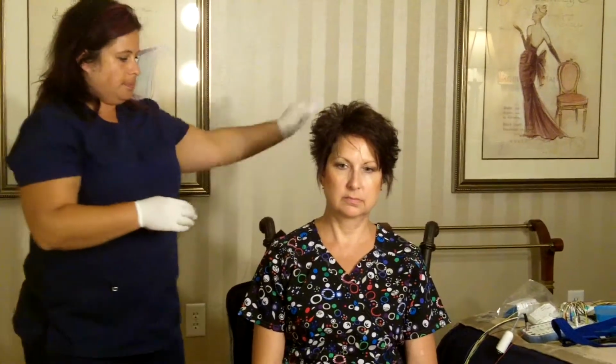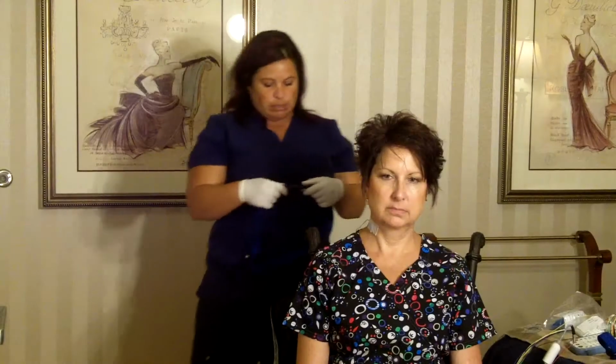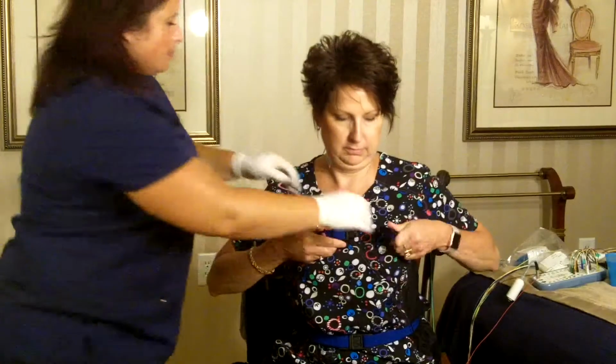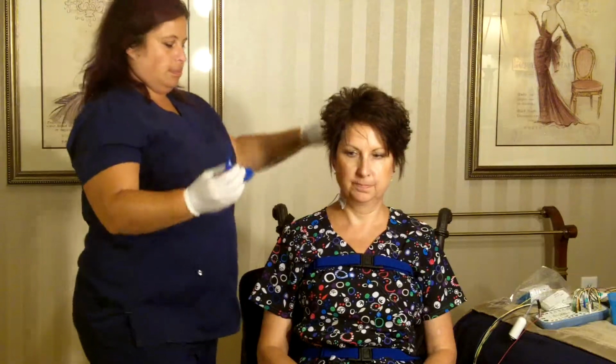Next, a snore microphone is secured on Kayla's neck to record if she is snoring. Mindy will now place 2 belts on Kayla to monitor her breathing effort. One is secured around her abdomen, and the other is secured around her chest. This body position sensor is Velcroed onto a belt so the technologist can document what position Kayla is sleeping in.